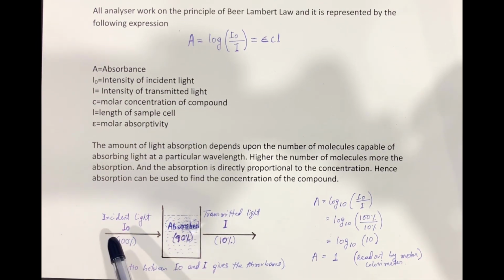Let us say the incident light is 100% and 90% of the light is absorbed by the sample. The 10% of the light would be transmitted. The ratio between this incident light I0 and the transmitted light I gives us the absorbance.